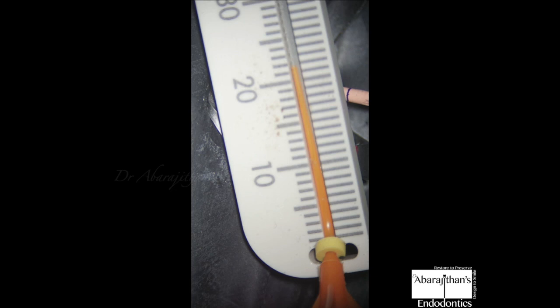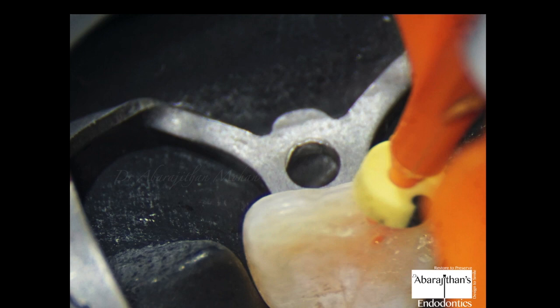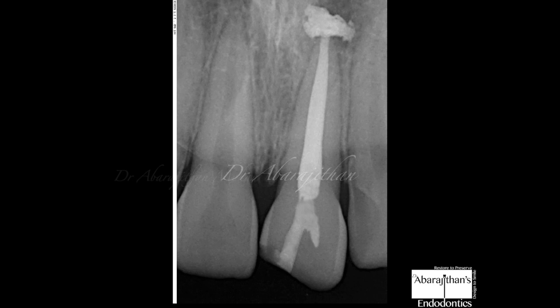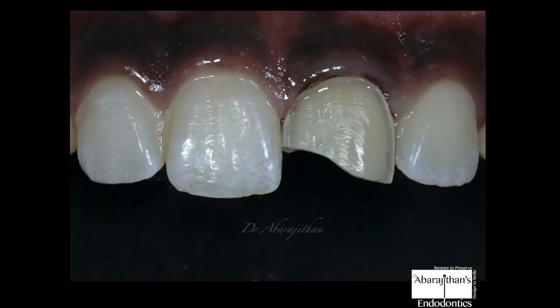In this case I did not perform a separate apical barrier — the canal was completely obturated with bioceramic sealer. I measured the working length, ensured a stopper on my applicator tip, and directly injected the bioceramic sealer into the canal. You can see there is a lot of sealer extrusion, which is definitely not good. Although sealer extrusion in the anterior region may not always cause a problem, endodontic material must be restricted within the apex. This extrusion was not intentional, but it still occurred.